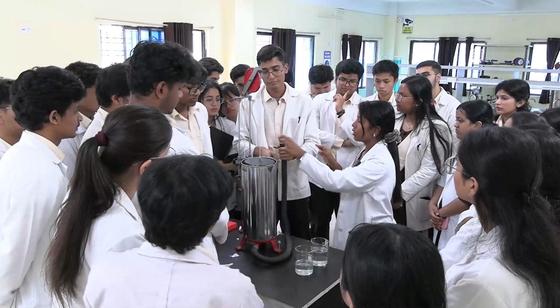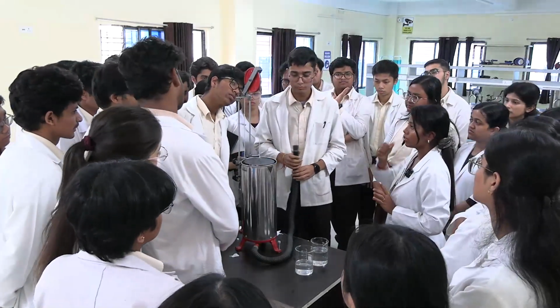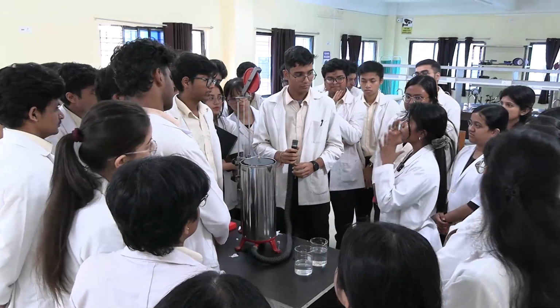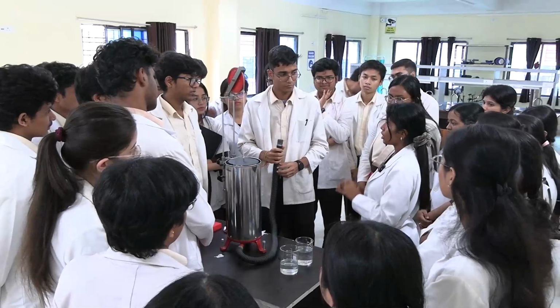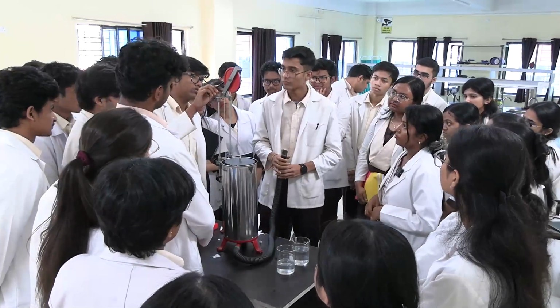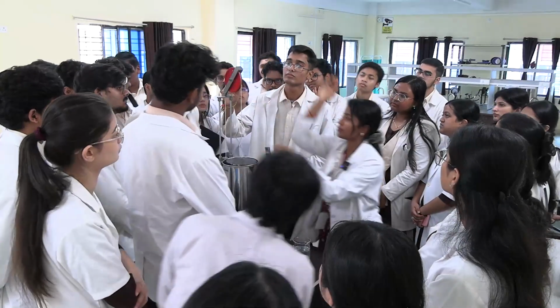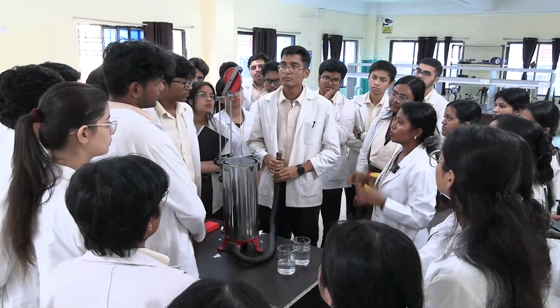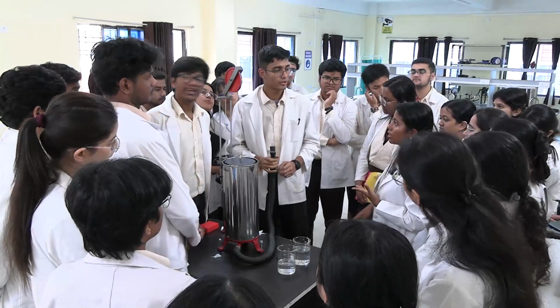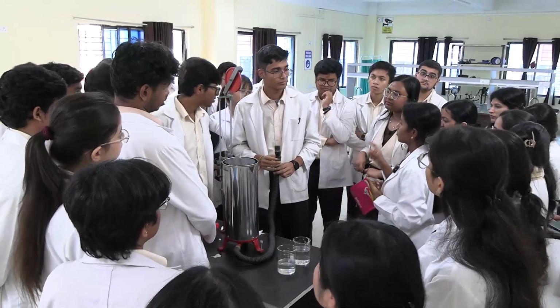leakage. Okay, so you have to take maximum inspiration. Then close the nose, breathe out from your mouth maximally, forcefully, as much as you can. Okay? So you have to take three readings in standing, and three readings in sitting. Then you have to take out the best one. Best means which is the maximum value.